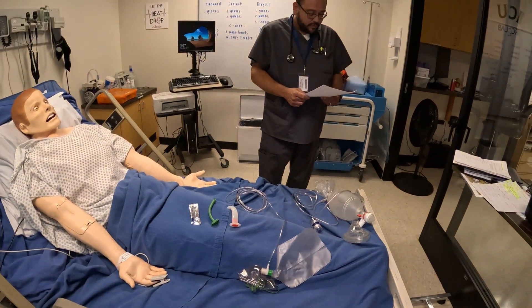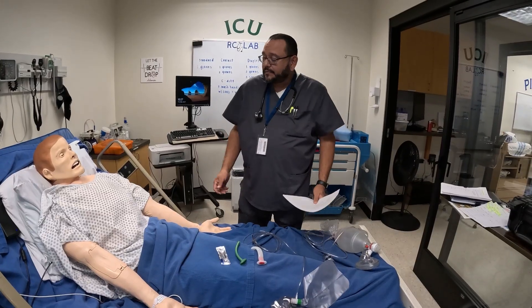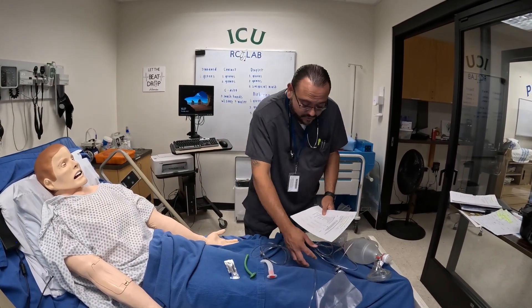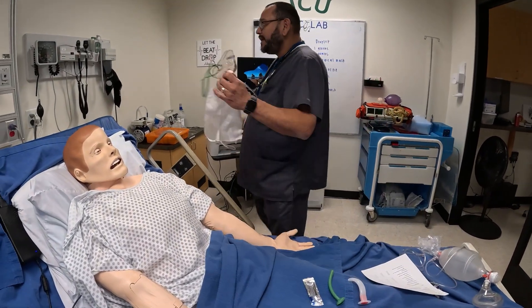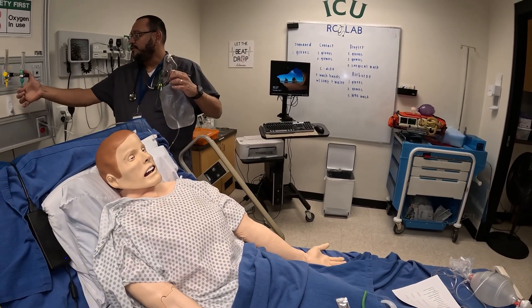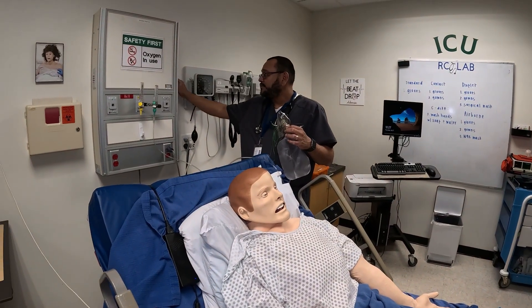We're going to go ahead and assemble the mask. 'Mr. Smith, my name is Harvey — I'm going to go ahead and put a mask on you.' Always introduce yourself and tell the patient what you're going to do. We have this mask and for demonstration purposes I'll turn the air on briefly.